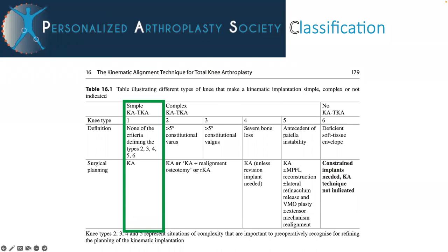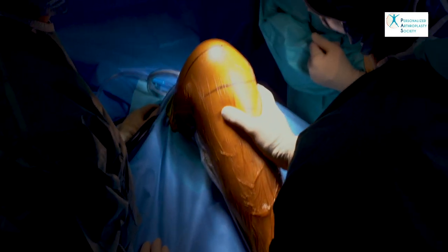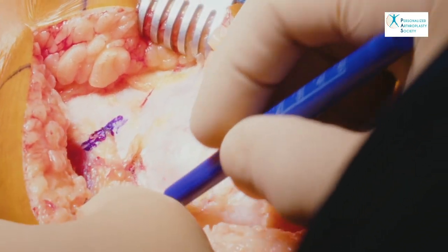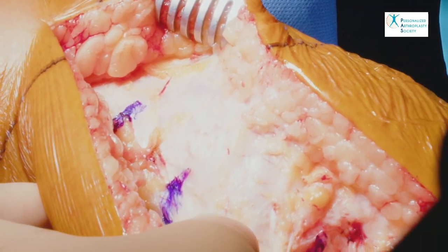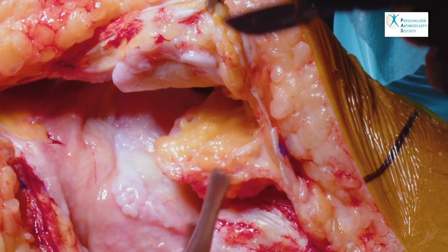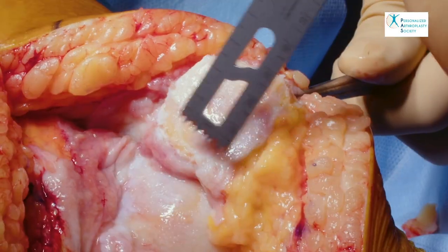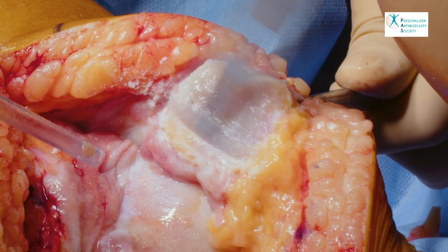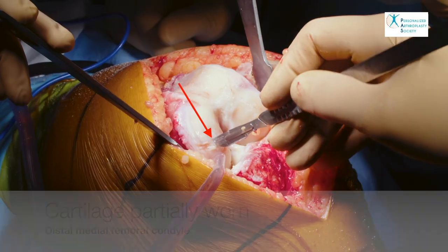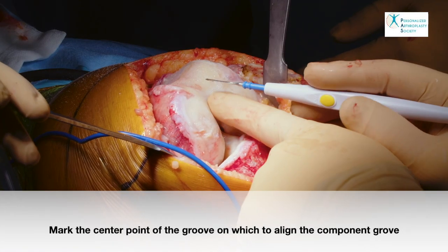We proceed with our standard technique. We proceed with the incision and arthrotomy, which is marked with a sterile surgical marker to be certain that it is closed anatomically at the end of the procedure. That is to prevent any alteration of the normal patella tracking. The fat pad is removed. We only resurface the patella as a last resort measure to improve tracking. Osteophytes are removed. The patella is denervated. The lateral facet is lightly reshaped to optimize engagement in the prosthetic trochlea. Here a scalpel is used to determine the cartilage wear or preservation and decide on cartilage compensation for the femoral cutting guides.